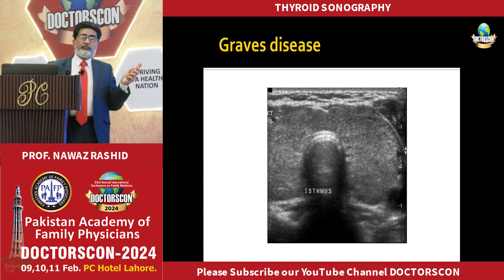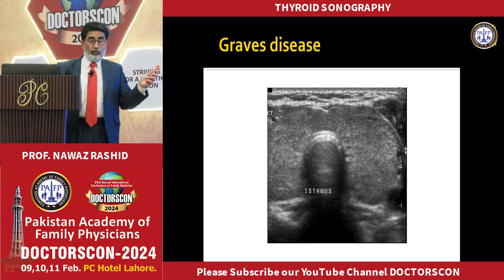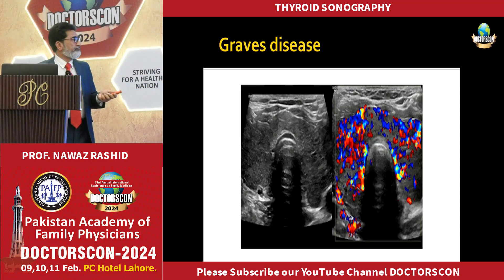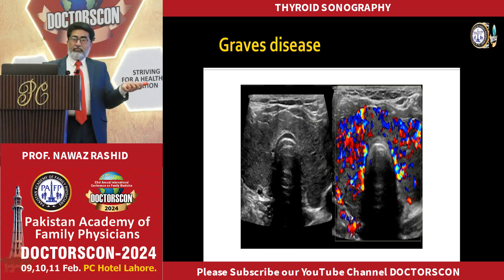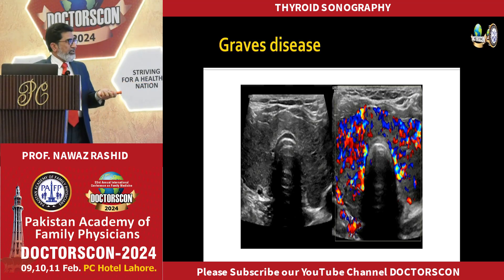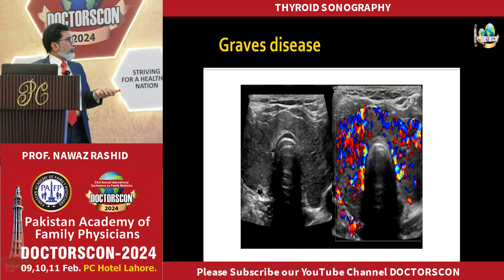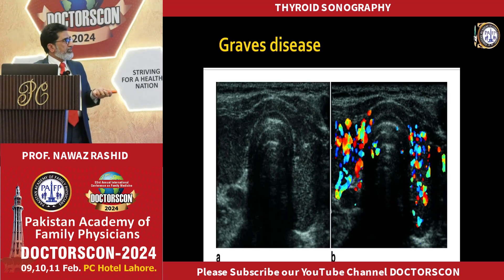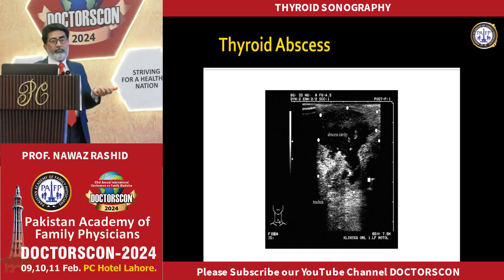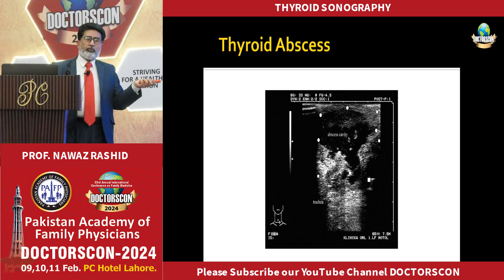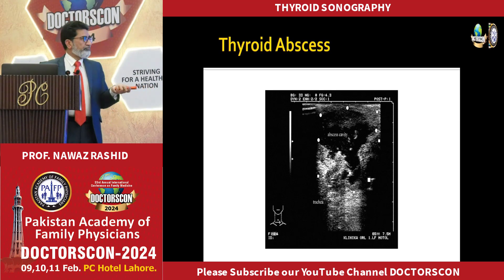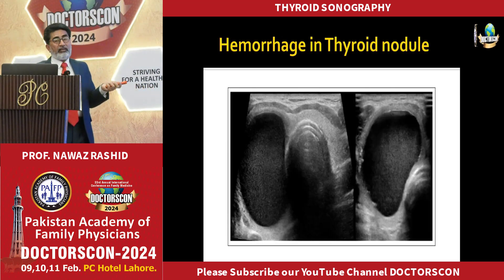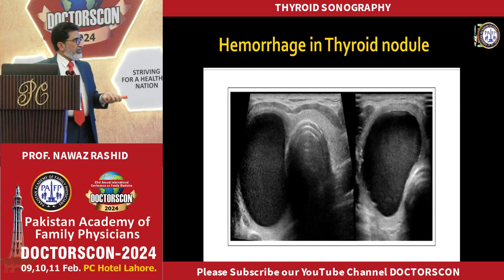Diffuse enlargement of both the right and left lobes. If you do Doppler, there is increased blood flow — this is consistent with Graves' disease. There is also a case of thyroid abscess; you will have pain, tenderness, swelling, and signs of inflammation. If there is a hemorrhage, it will look like this — with fine internal echoes.